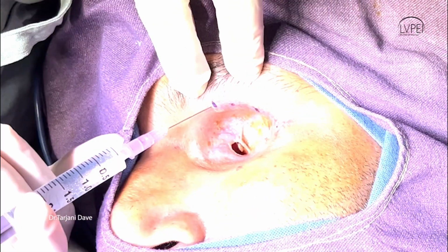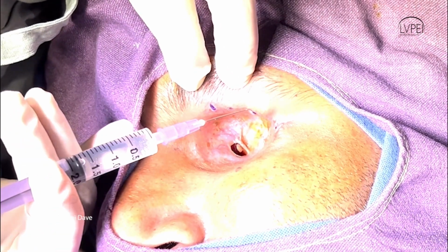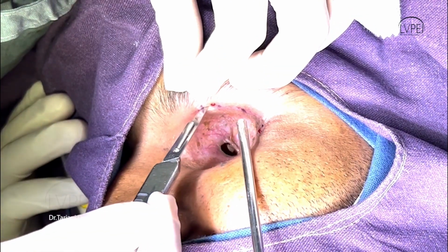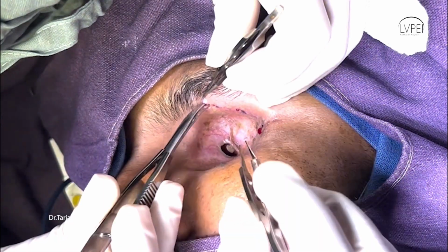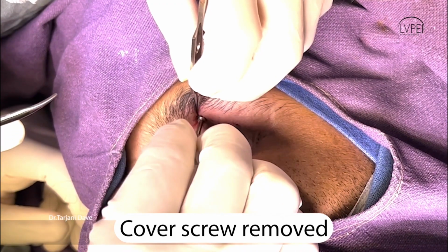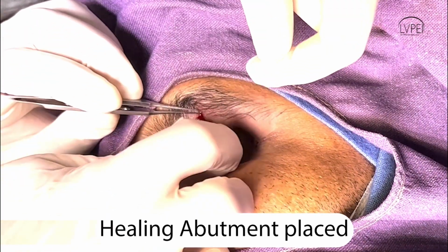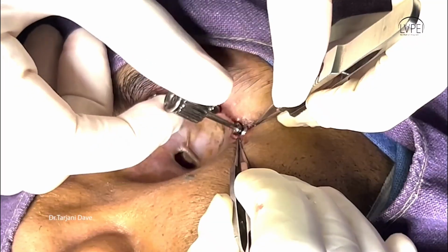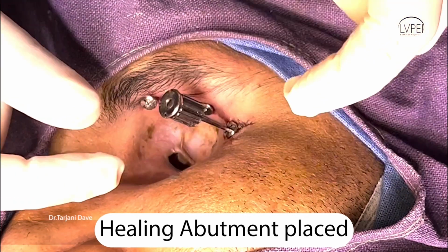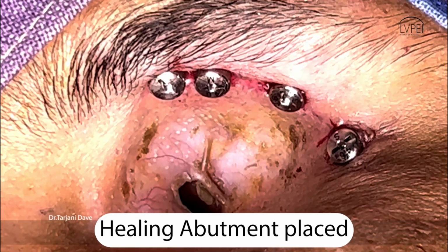The cover screws are palpated over the skin and the skin markings are made. Local anesthetic agent is infiltrated subcutaneously. With a number 15 blade, small skin incisions are made to expose the cover screws, and the cover screws are removed gently. Healing abutments are placed inside the implants now in order to form a fistula around the implant. So the basic concept behind step 2 is that the cover screw is removed from the implant and a healing abutment is placed in order to form a fistula and is exposed to the outside.